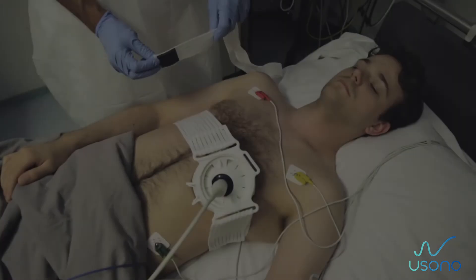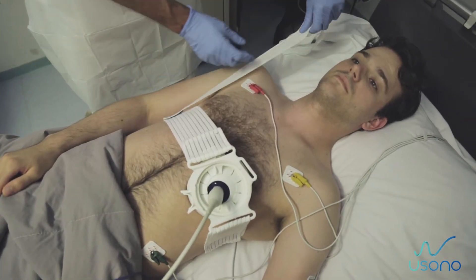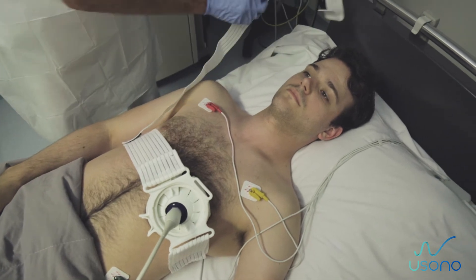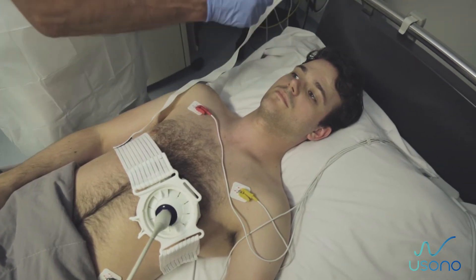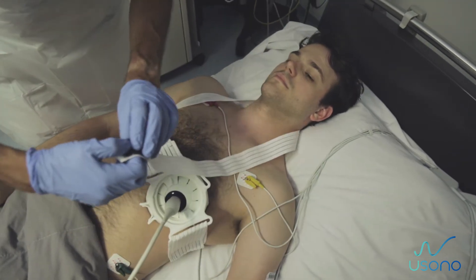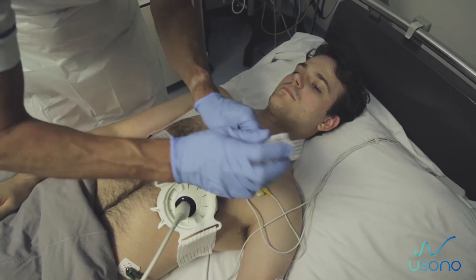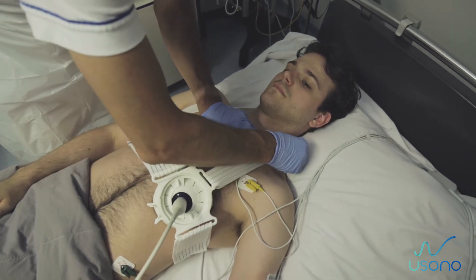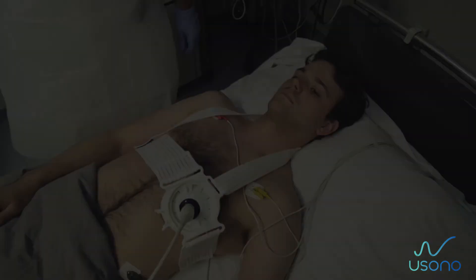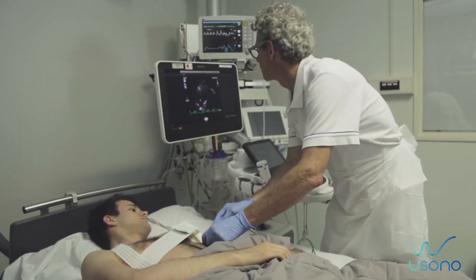If needed, apply the shoulder strap. Attach the shoulder strap to the base strap around the body, then pass the other end of the strap around the patient's neck. Place this end through the strap opening of the probe fix, ensure that the velcro side is correct, and fixate the velcro on the shoulder strap.